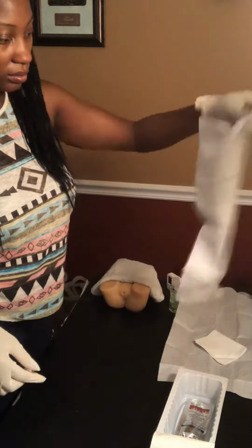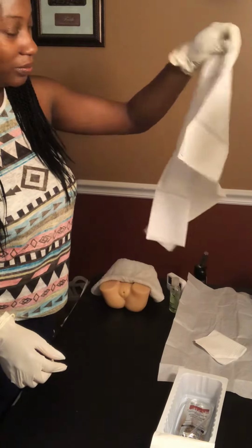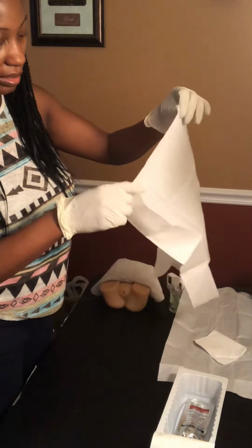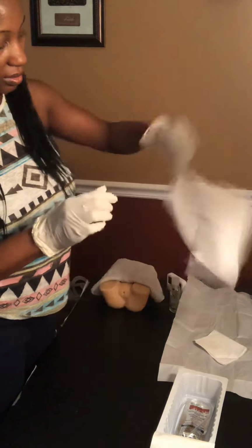And sunny side down. I mean, the shiny side down. It's sterile, so I can touch it. But let me practice as if I did not have on the gloves.